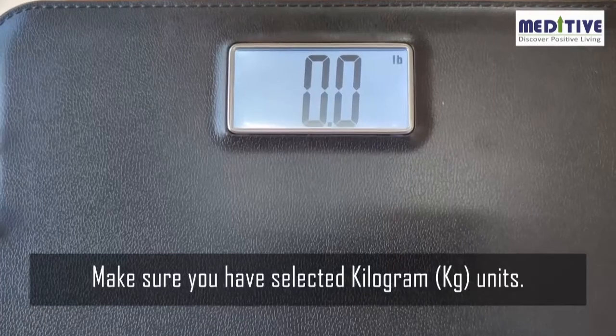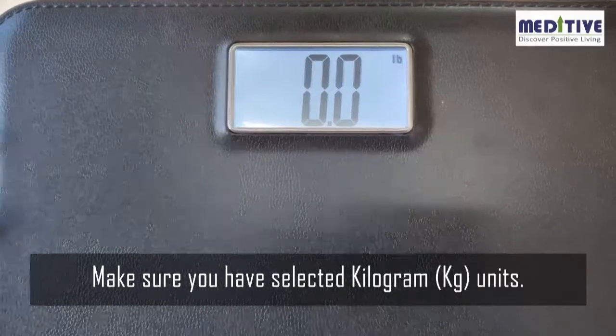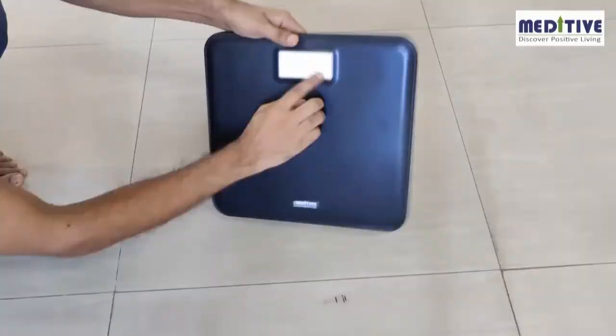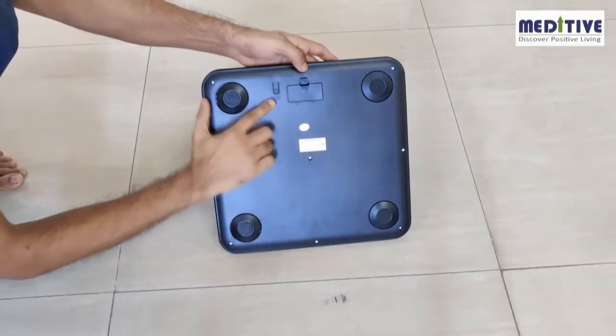This scale has multiple units of measurement. Make sure you have selected kilogram units. The units can be changed by pressing the button behind the scale.